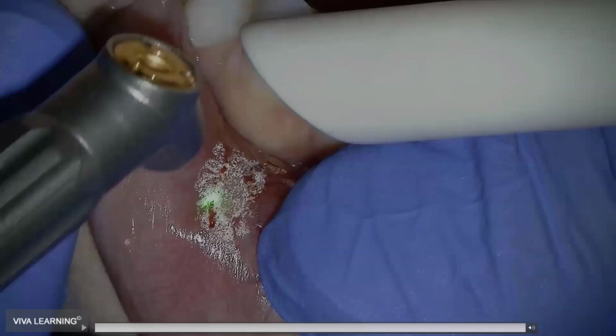So if anything, what I prepare the patients for to do anesthesia-free dentistry is I say, hey, this is the great part. No numbing, no drilling today. What you will feel is a little cold from the water spraying down on the tooth, and that's it, right? Because I want them to know that they'll feel a little bit of that washing effect, not unlike when you finish up a teeth cleaning and you're rinsing off the pumice, kind of like that. So pretty amazing with that.